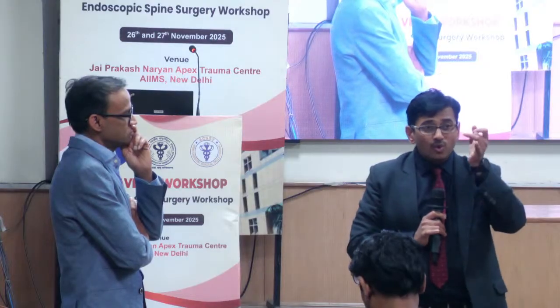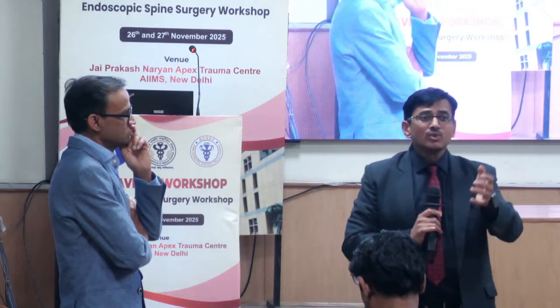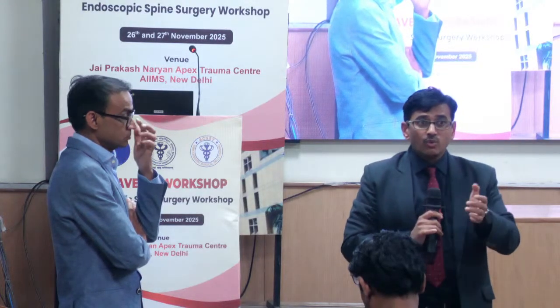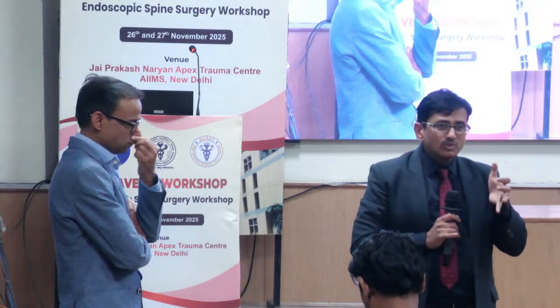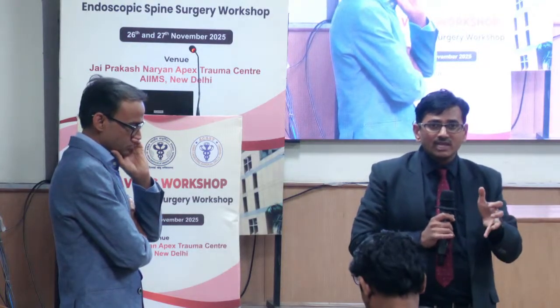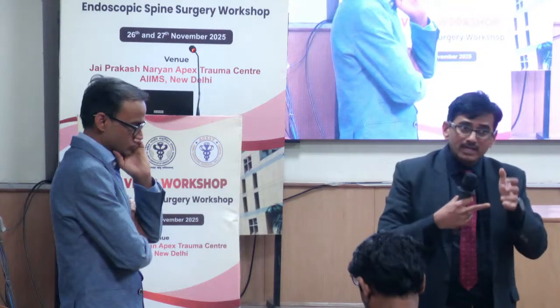When you are doing Easy GO, it is like open surgery. You are putting a tube, the rest of the things you don't have to do, both your hands are free. But when it comes to Destandau, it is like a salsa dance. You cannot just do a rowdy kind of dance. You have another suction in your hand.